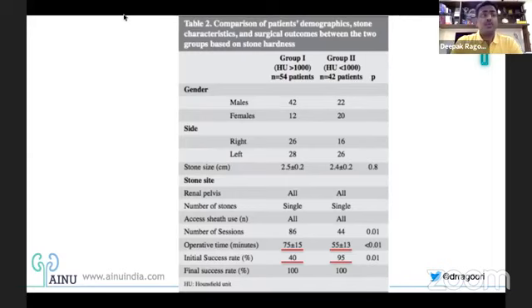If you can see these two groups, patients having stones more than 1,000 Hounsfield units and the other group having stones less than 1,000, there's a significant, a clear-cut demarcation. If you see the ones I've marked with red, significantly the operative time is more in the harder stones, with a success rate which is quite comparably less when you compare with softer stones. But I guess there are papers coming now which will actually negate the same data, with better lasers and more efficient scopes.